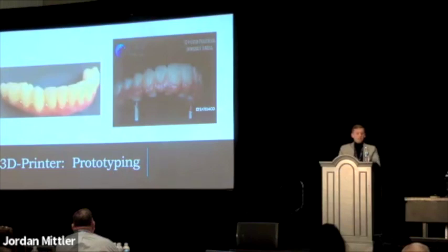About 18 months ago when we were getting into this, some of the more experienced doctors were saying you can't do it with resin. You have to do milled restorations. It's not adequate. But in the last few months, with the new resins geared towards full arch, it is better, in my opinion, and the research will show, better than most milled materials out there. Very aesthetic, very low water absorption, so minimal color change, and so on and so forth.